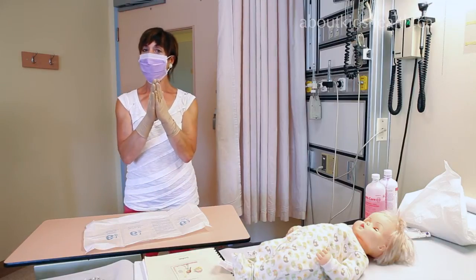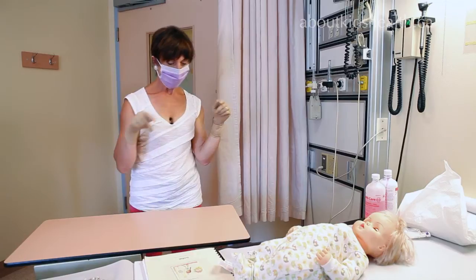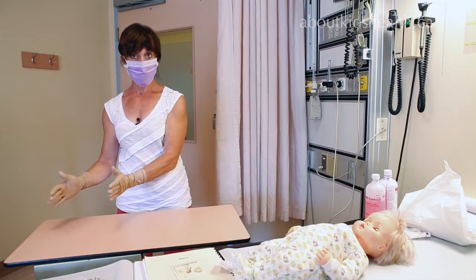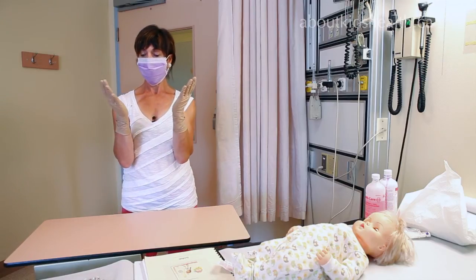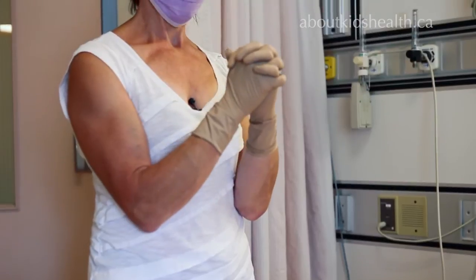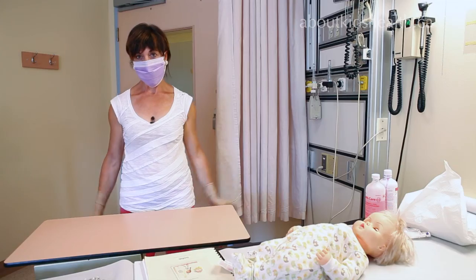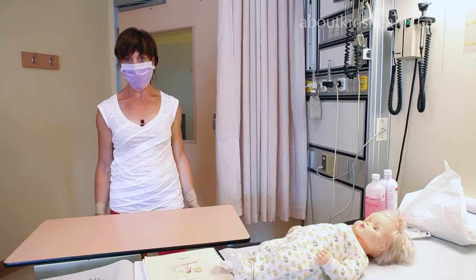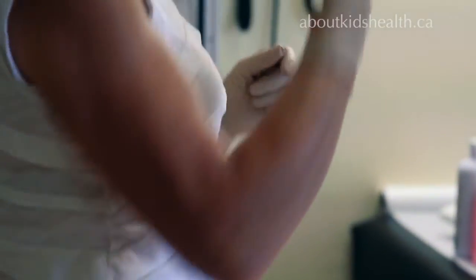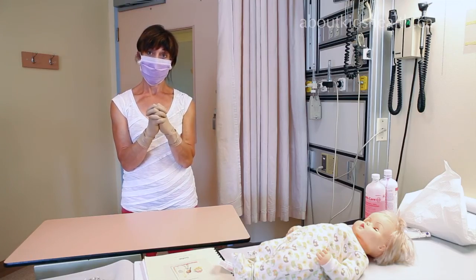You now have two sterile gloves on and are not allowed to touch much of anything. Your tray would either be presented to you or left here ready for the procedure. The correct positioning of your hands after gloving is in front of you, so you remember they're sterile. Don't put them down by your sides — the first thing you'd probably do is touch your pants — so hold them together in front of you as a reminder. You are now ready for the procedure.